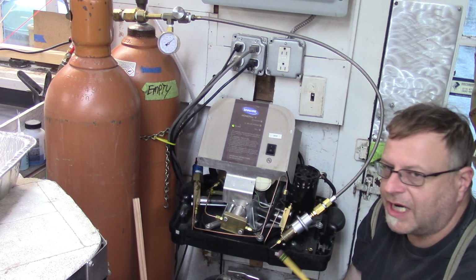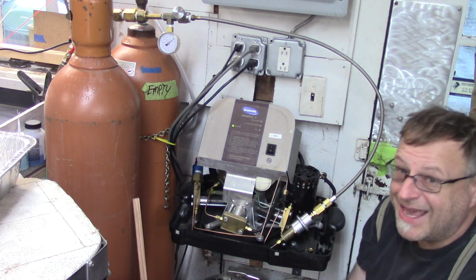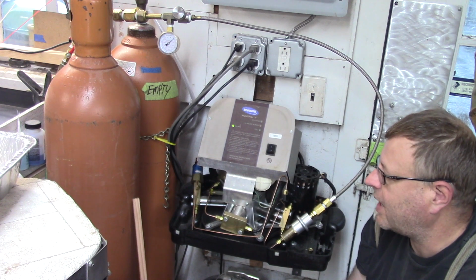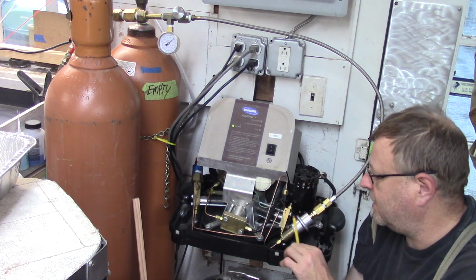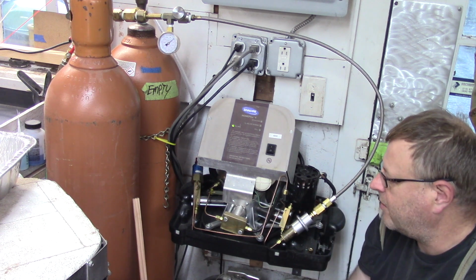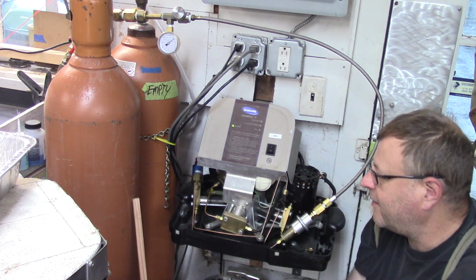By doing that, I know I changed the bore size. When all of this is said and done, I have access to a tool shop, and I'm going to take the cylinders to the tool maker and have him measure them, and he can tell me what the bore is. His equipment and his expertise is a lot greater than mine. I can read a mic, I can read a caliper, I know how to work a snap gauge, but when you're down to the clearances required to make this thing operate, you're into 5 or 6 decimal points below my equipment's measuring ability, and he has that equipment. So there you go. How to bypass cylinders number 4 and number 5 in a long-winded manner.